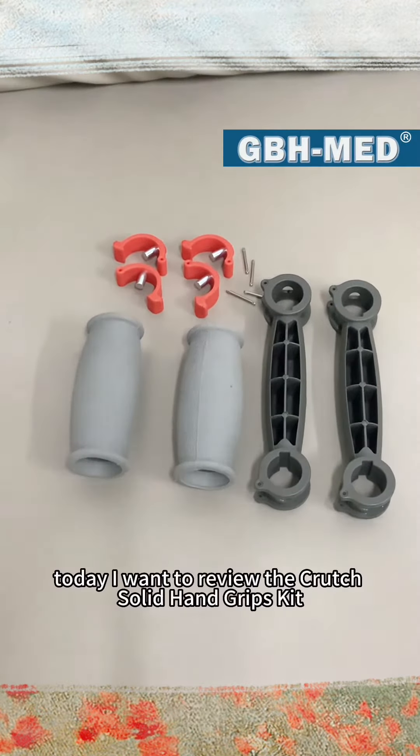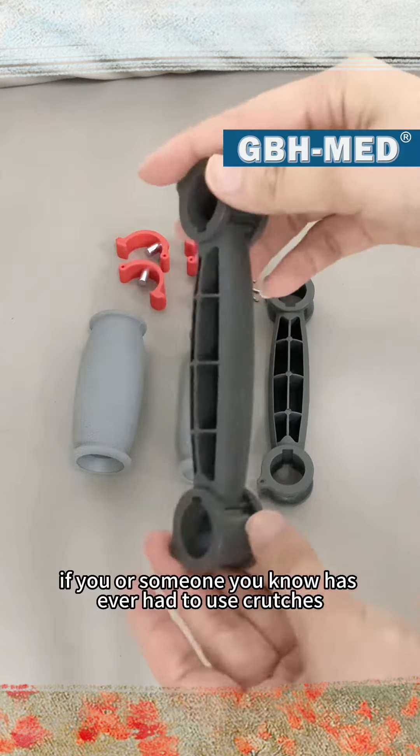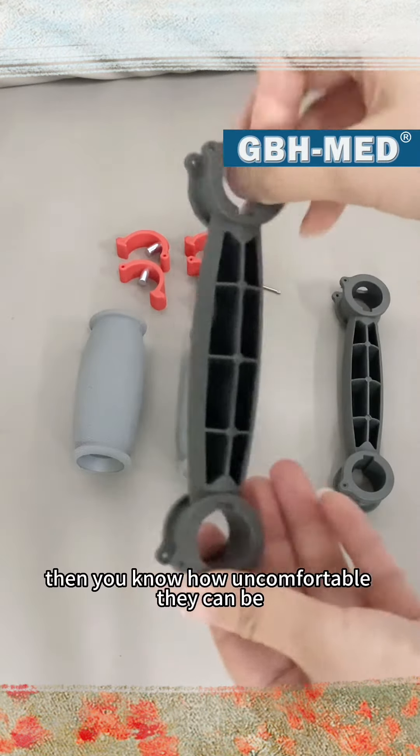Hey, what's up guys! Today I want to review the Crutch Solid Hand Grips Kit. If you or someone you know has ever had to use crutches, then you know how uncomfortable they can be.